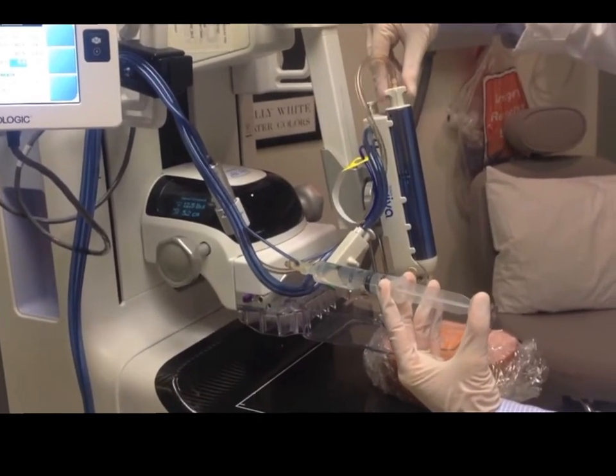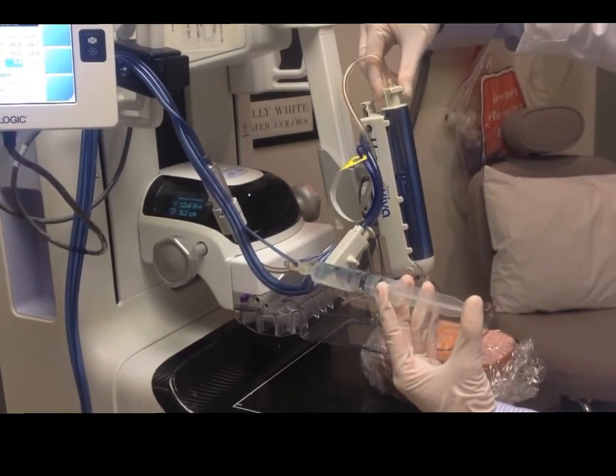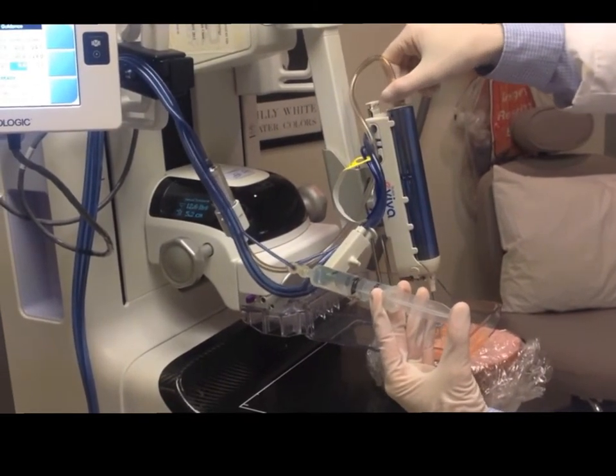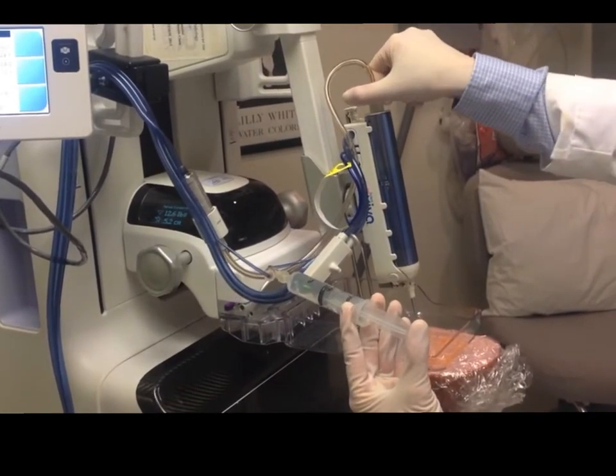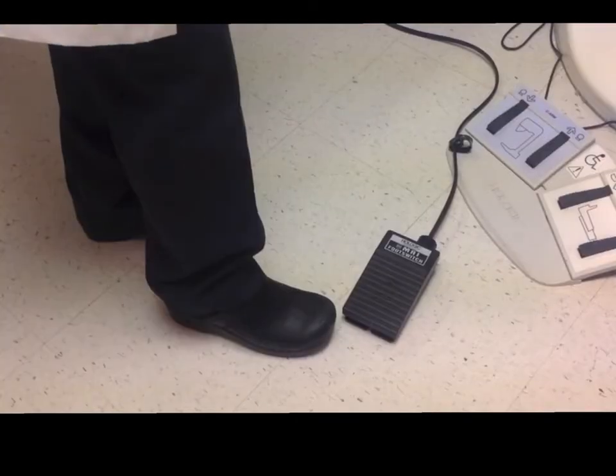We then inject another approximately five cc's of lidocaine through the back port, gradually turning the needle round in the patient to get all areas of the proposed biopsy site as you go.